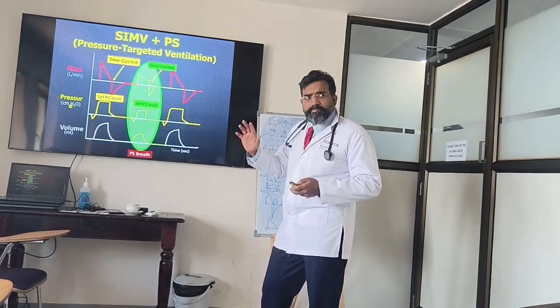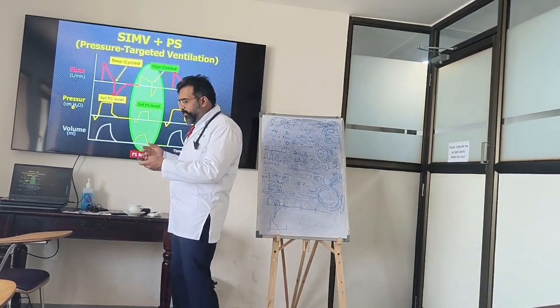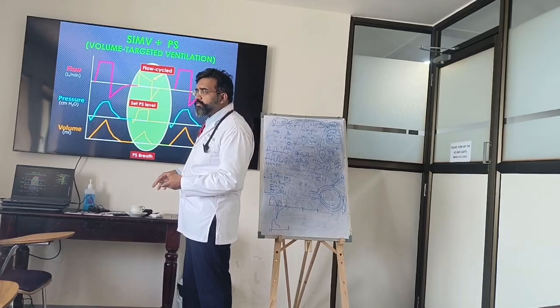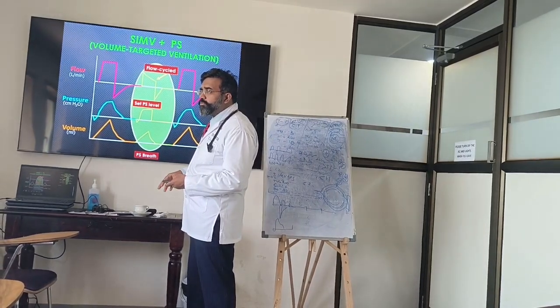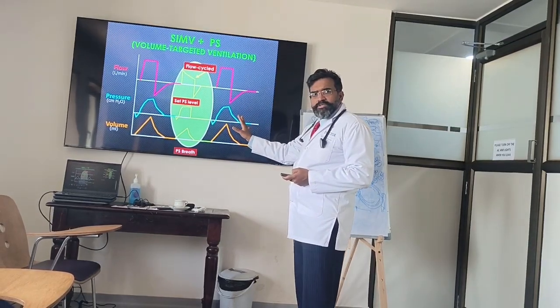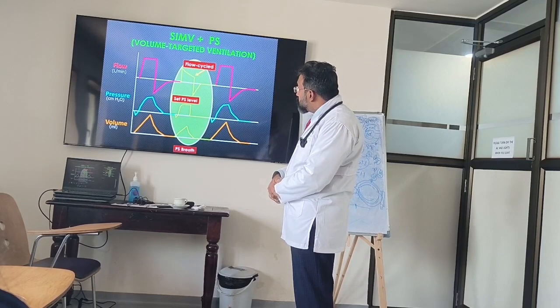So this SIMV can be pressure controlled also. We have not just talked about SIMV, no? We told SIMV is... Clear on this? Sir, in this, like, set pressure.